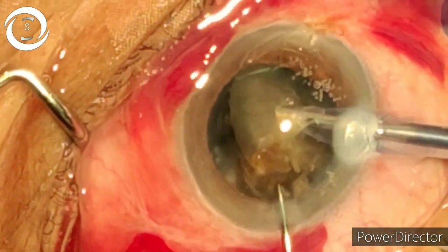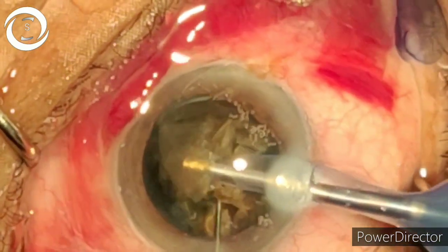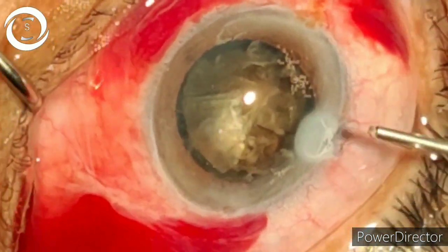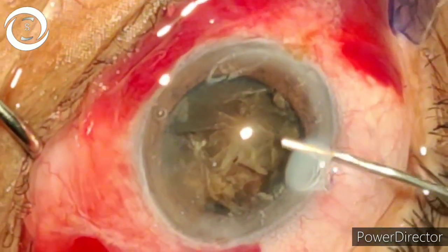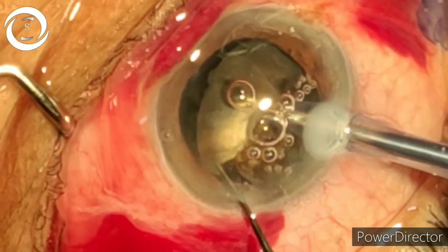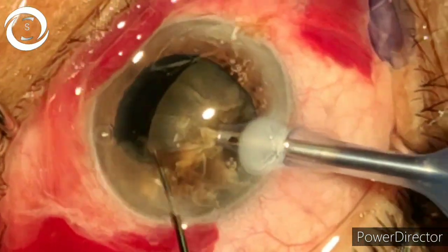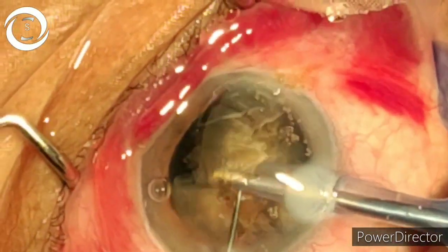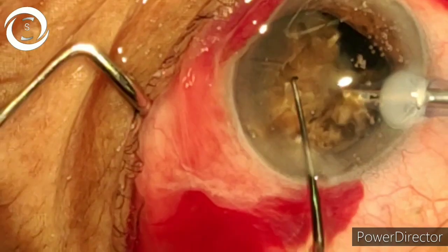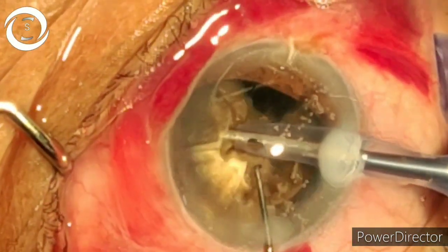Before this case today I performed two phacoemulsifications and they were soft cases, done in no time — but this was a tailor-made case for extracapsular cataract extraction. However, now we have divided it and are using as much viscoelastic as possible. We have emulsified almost more than half of the nucleus.